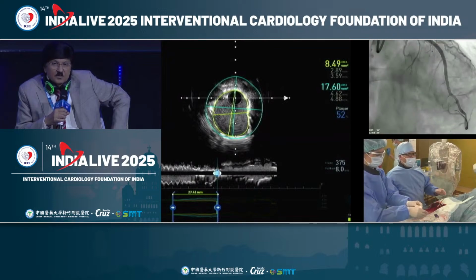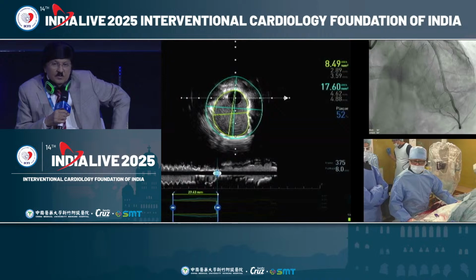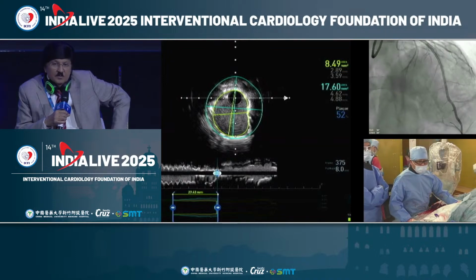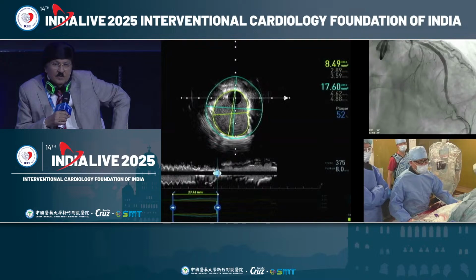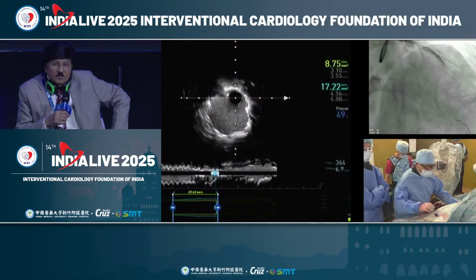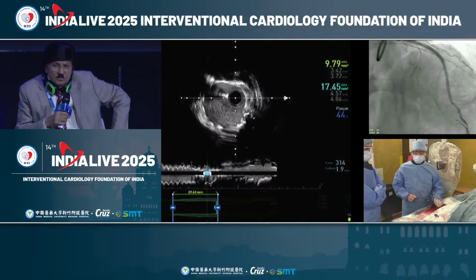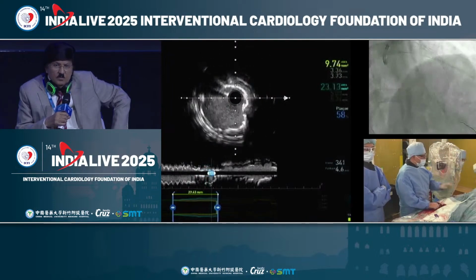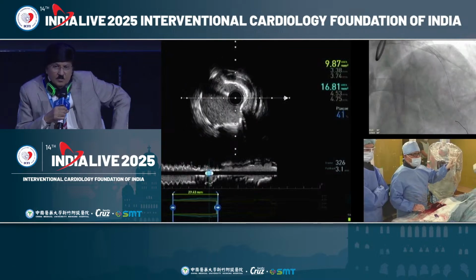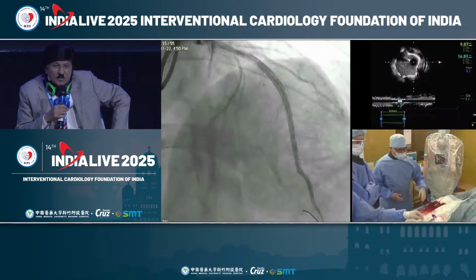So today I did the 2-burr rotablation. Without rotablation, with only a cracking technique, nobody can achieve this good result in this calcified region. So we always have to make a combination, cracking and volume reduction technique. So this is the final angiogram, like this, and there is no remaining disease in the side branch.